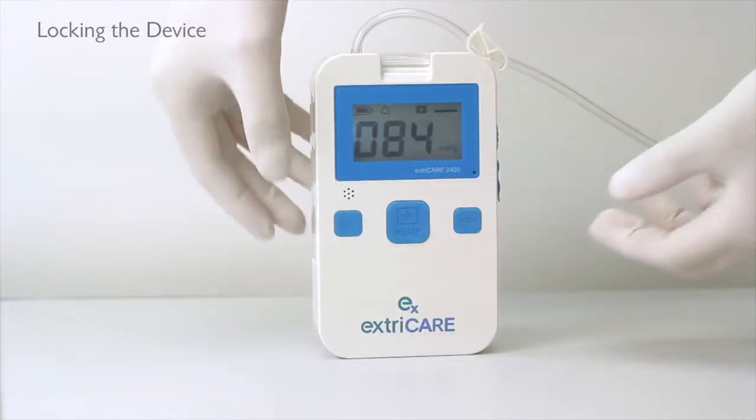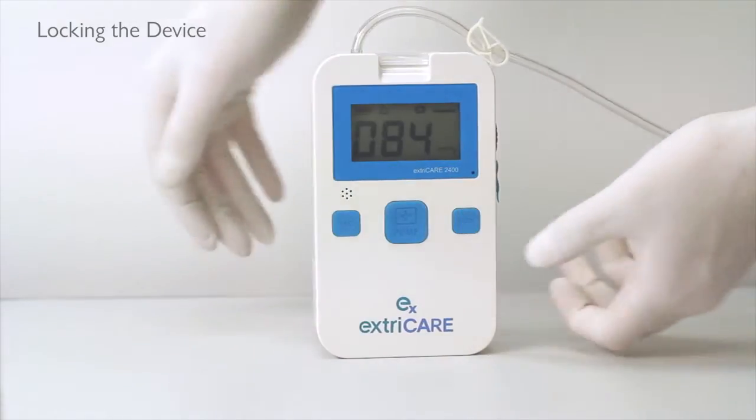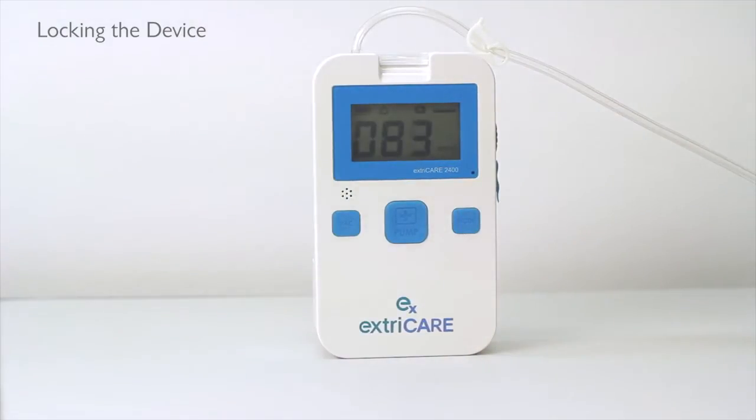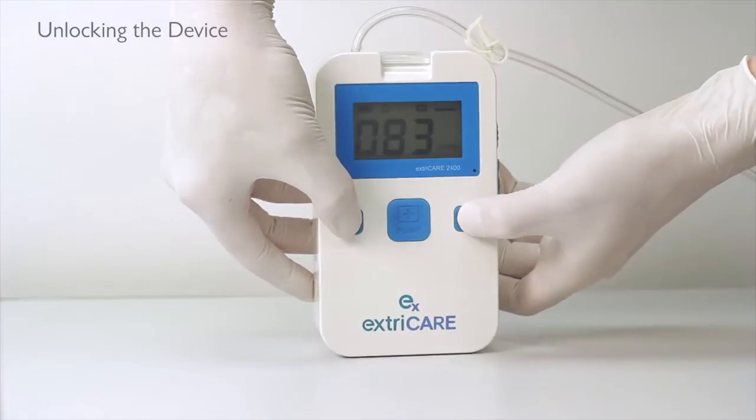To lock the device, press down simultaneously on the SET and MODE buttons for 2 seconds. The screen will dim, showing the device is locked. The device will automatically lock after 60 seconds of inactivity. To unlock the device, press down simultaneously on the SET and MODE buttons for 3 seconds.